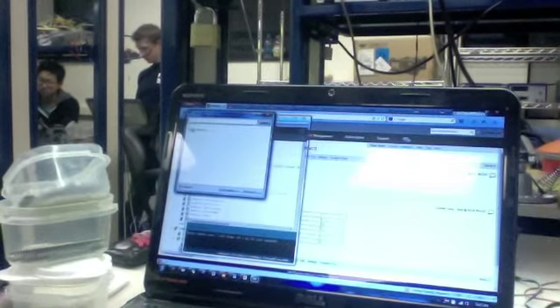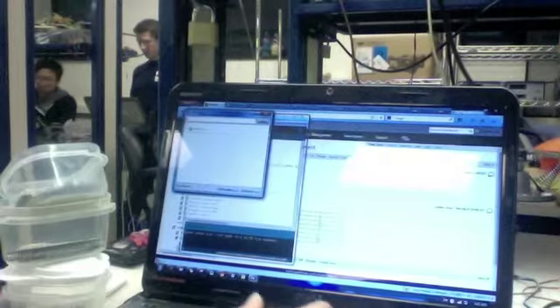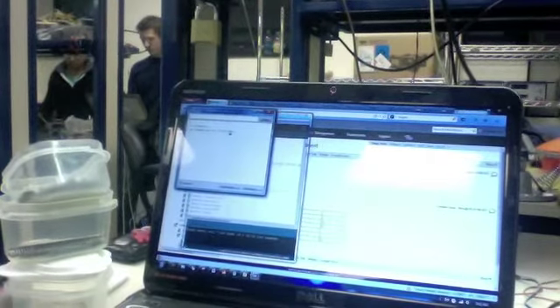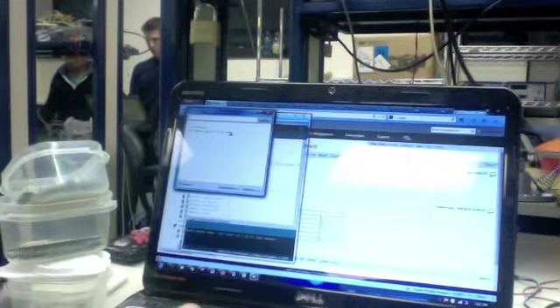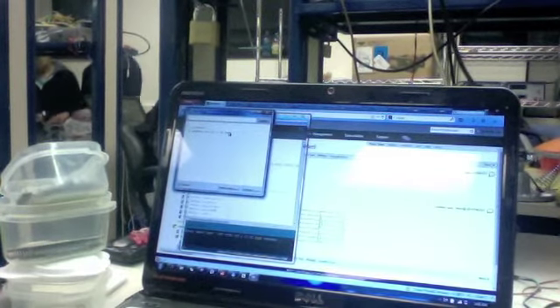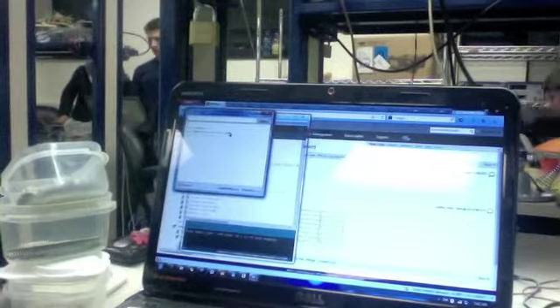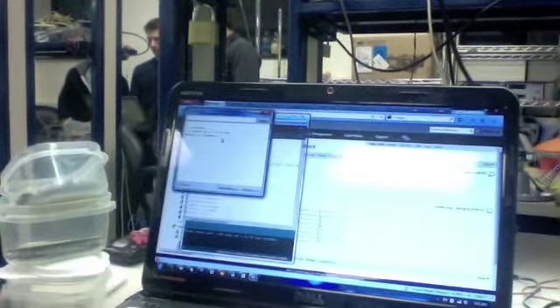So you have some options to be able to tell it what to do. If you type a G and send it, then it sends all of the data that it has collected. And it has sent a message here acknowledging that. If you type an S and then another character, for any of the parameters that you might want to set, say the amount of time you want to cool for, and then the value of that, and hit enter, then it sends a message that says it has changed that parameter.